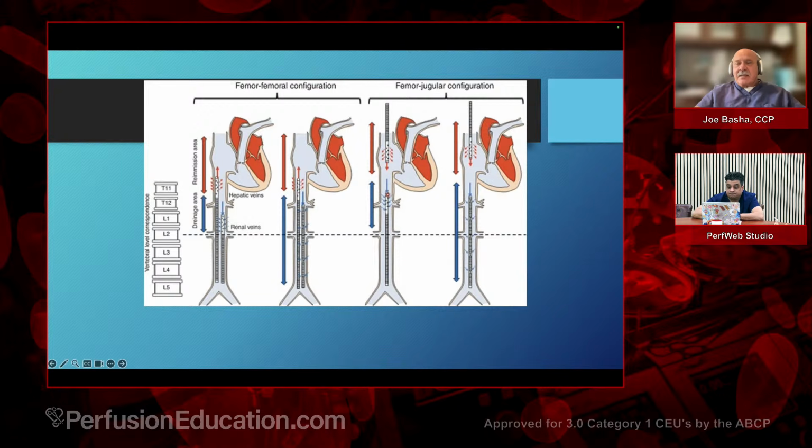Now here you see this cannula, it's a little higher than the hepatic vein, and your return in the mid portion of the right atrium. I would want to pull this back some, but this is another technique, and this is just illustrative of the same technique using just a different cannula. This one has fenestrations farther down, and this only has the multiple fenestrations up more towards the tip. So you have different types of cannulae that you can use, and I think that's what they're showing here.